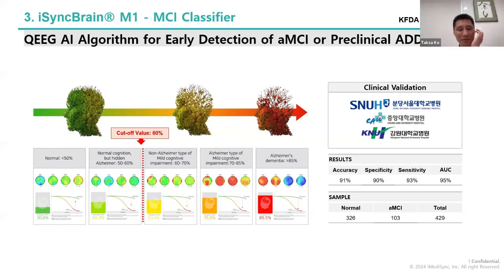This MCI biomarker in Korea is a KFDA software medical device, and we give the introduction to the clinician. This is the clinical decision support system, not the decision itself.